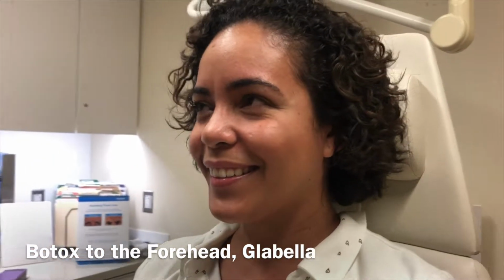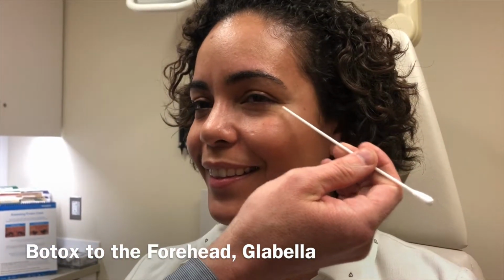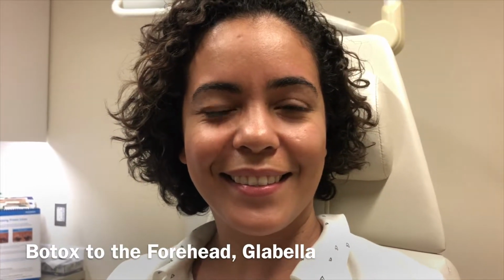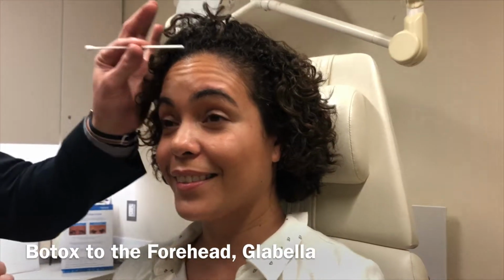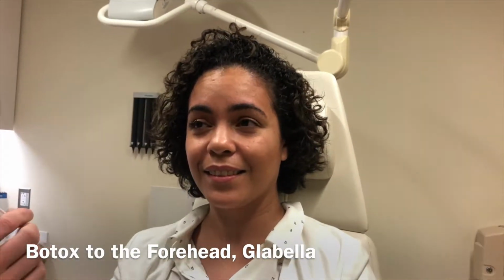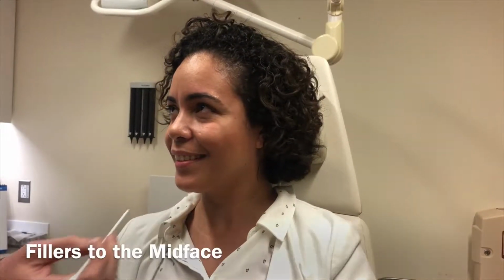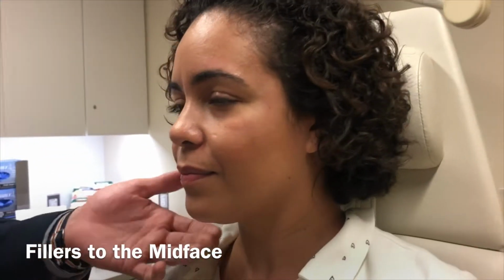And then give me a big smile too. So not too much in the way of crow's feet. Some people have wrinkles right here, but you can do as much or as little Botox as you want in that area. We're gonna avoid that today. So once again, raise your eyebrows up. So some Botox right there. Bring your eyebrows together. And then right here in the corrugator muscle right there. And the procerus muscle. And then lastly, we're gonna give you a little bit of volume right here in your cheeks. So I'll show you.